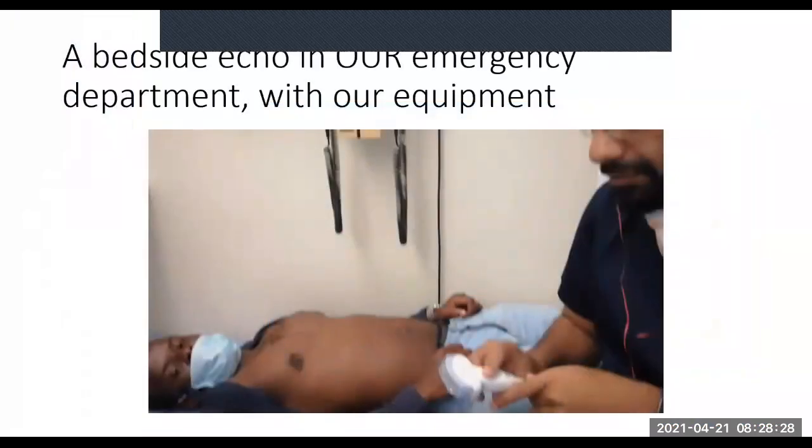So let's just get past that. All right, so here's a bedside echo in our emergency department with our equipment, all right? So let's watch that. It's a bit long, but I hope you will enjoy it.